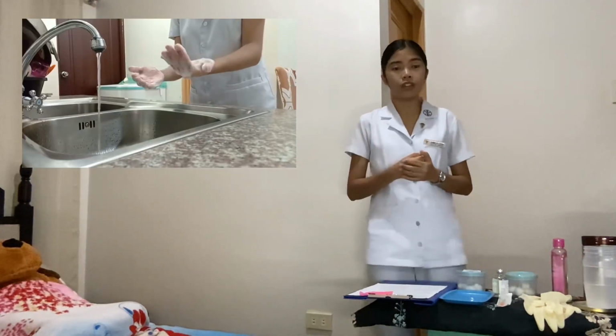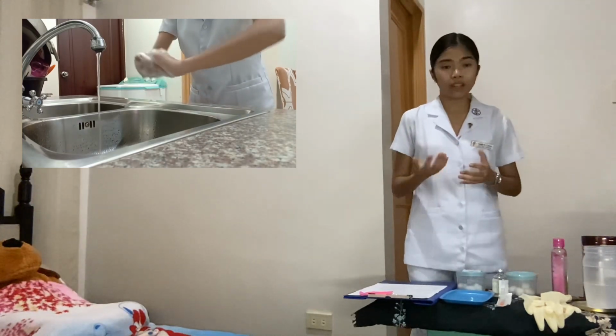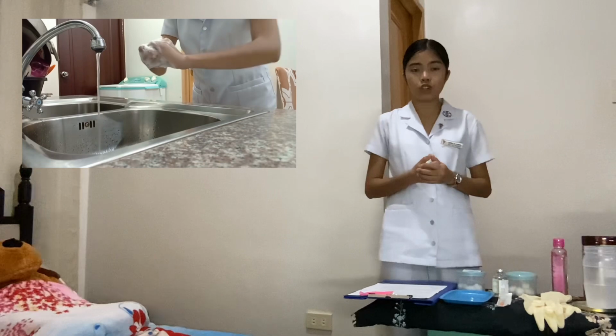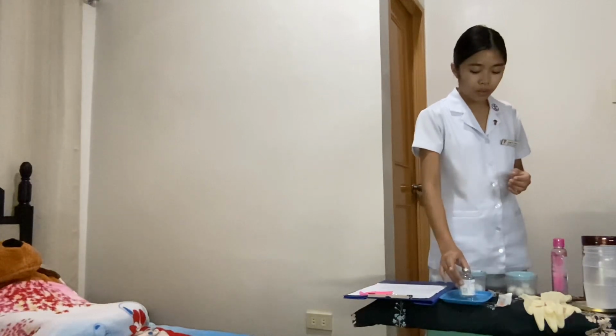Now, before we start preparing the insulin syringe, we should first perform the hand washing procedure to deter the spread of microorganisms and to prevent infection and cross-contamination. Then the next thing we're going to do is to prepare the vial for the drug to be withdrawn. So we're going to put that in our medication tray.